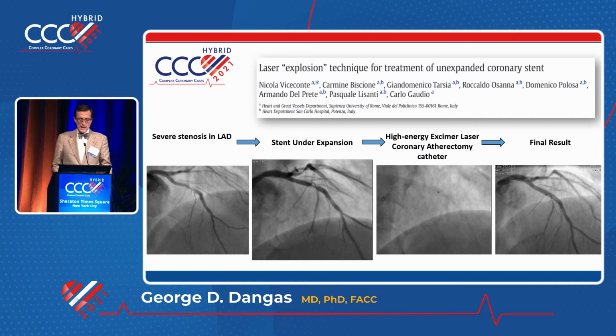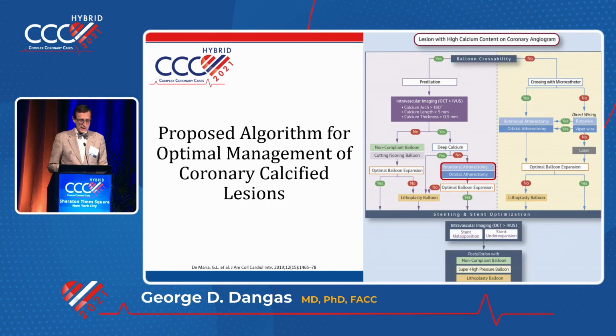What I was talking about, the off-label use of the laser explosion, not in any guideline. You have a calcific ridge that nothing can expand. You can see it right here, in the middle. If right there you do some laser passage of high energy, and at the same time you inject a little dye that induces a local bubble, that is possible. It's not recommended for inexperienced users, and it may actually help you.